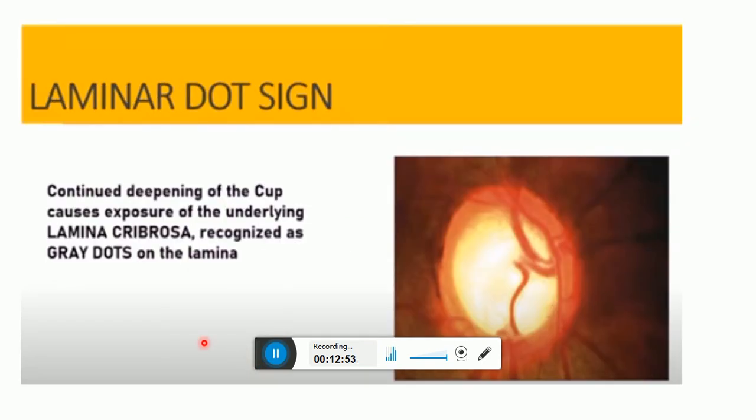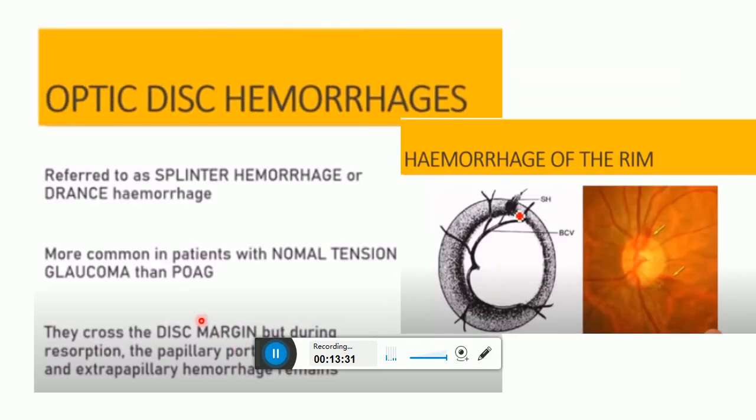The laminar dot sign occurs in advancing glaucoma. Gray dot-like fenestrations in the lamina cribrosa become exposed as the neuroretinal rim recedes. The fenestrations sometimes appear linear, and this itself may be a sign of advanced damage indicating distortion of the lamina. The dots may be seen in normal eyes. There is continued deepening of the cup causing exposure of the underlying lamina cribrosa, recognized as gray dots on the lamina. Optic disc hemorrhage is a risk factor for the development and progression of glaucoma and can be missed unless magnification is used to examine the disc.